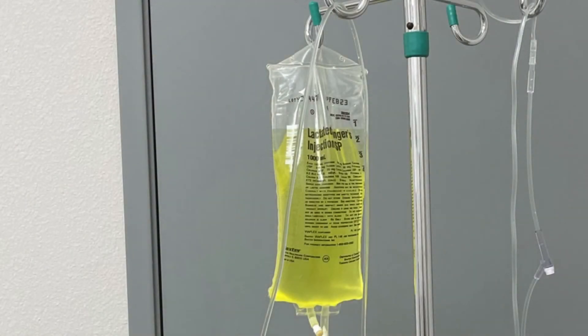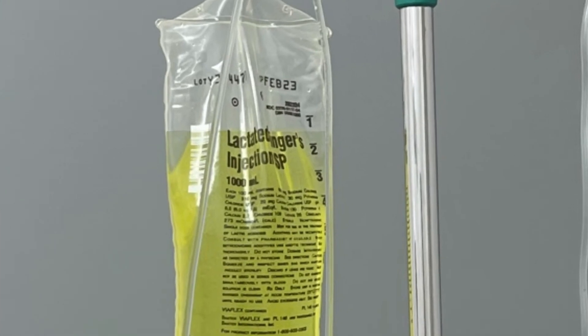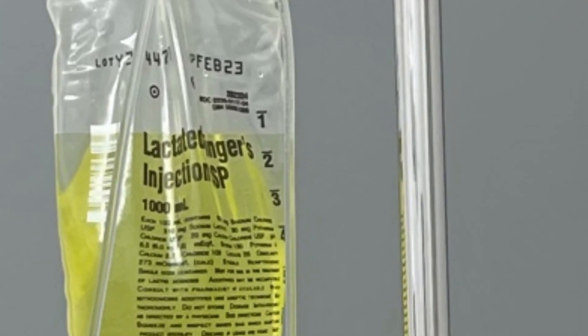This is how you check how much fluid is being given — the bag has lines and numbers on it, so the one means you've given 100 mils of fluids, two is 200. You want to double-check before you start giving fluids how much is in the bag and how much you want to give.